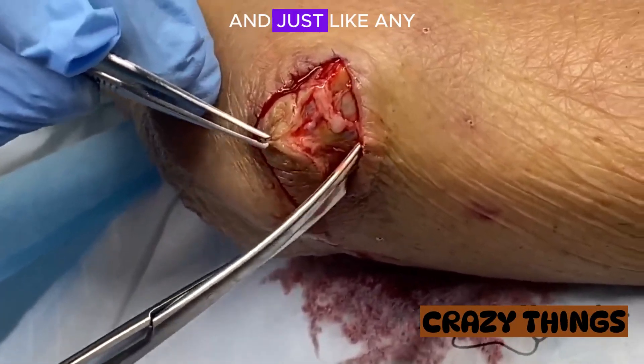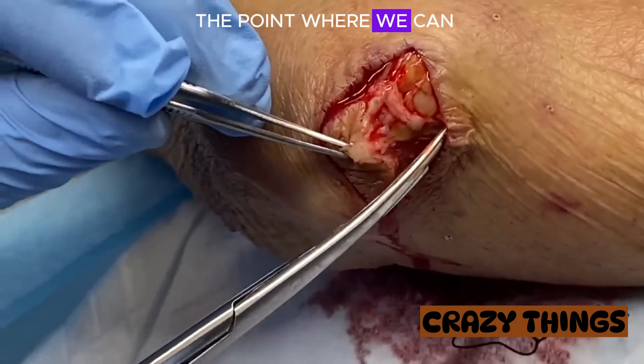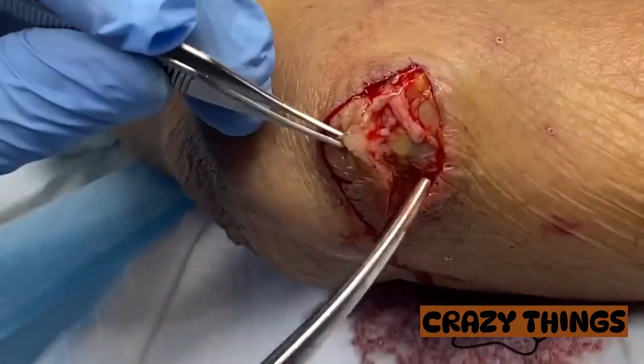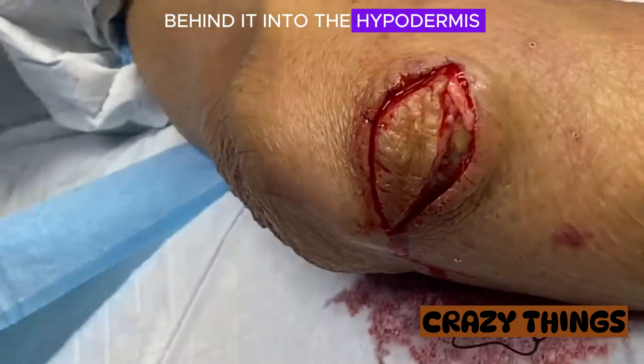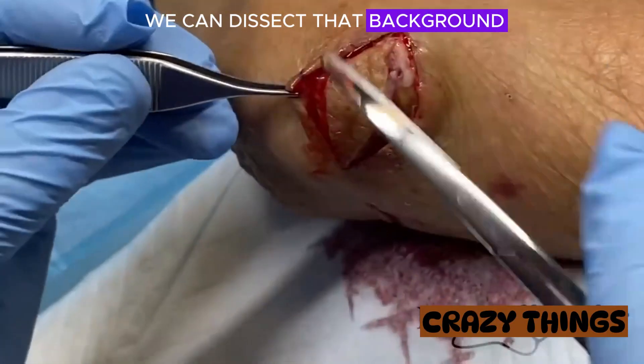We're breaking down adhesions, and just like any other cyst, we're trying to get it down to the point where we can see that we're behind it into the hypodermis, and then see if we can dissect that back around the other way.